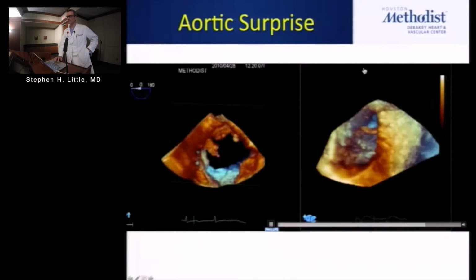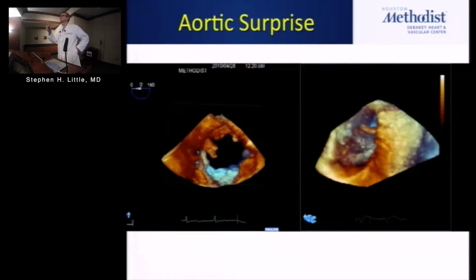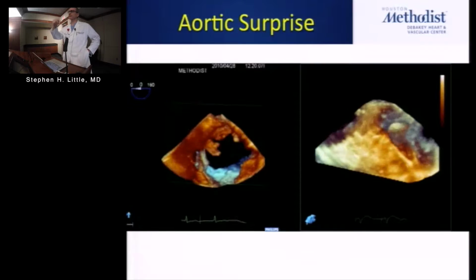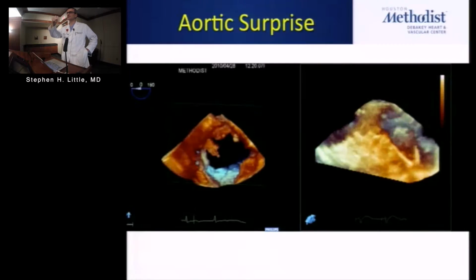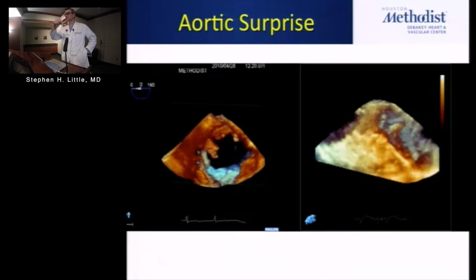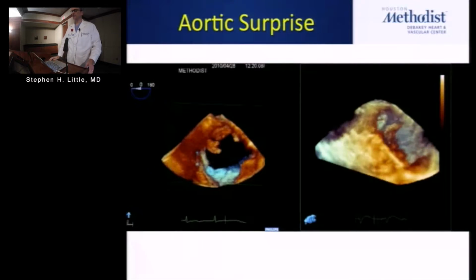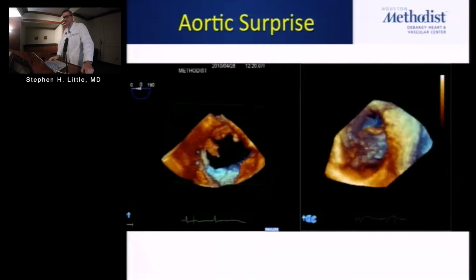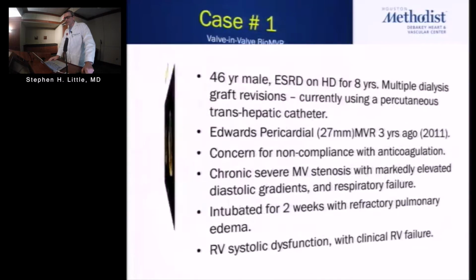This dissection was from an attempt to retrieve a valve. TAVR had been deployed, didn't like the way it was sitting, put a guide wire across, try to pull it up. But of course you're pulling from the groin, which means you're putting a lot of tension on the lesser curvature of the aortic arch as you try to pull the device up. So basically you're sort of sawing across a lesser curvature of a 90-year-old arch, and sometimes bad things happen like that. But that's not necessarily 3D.